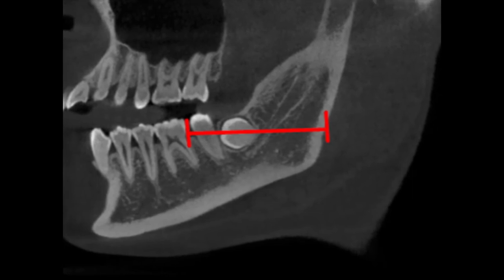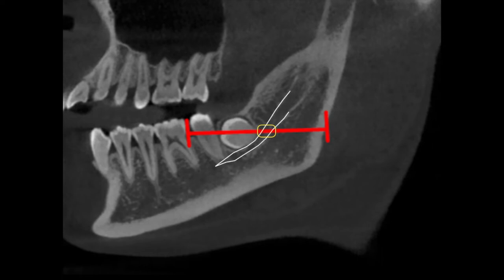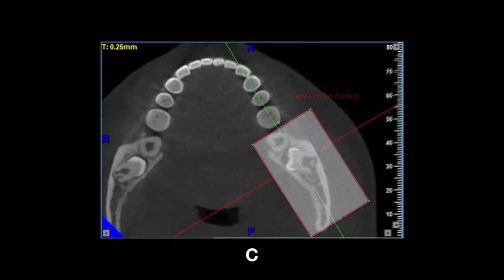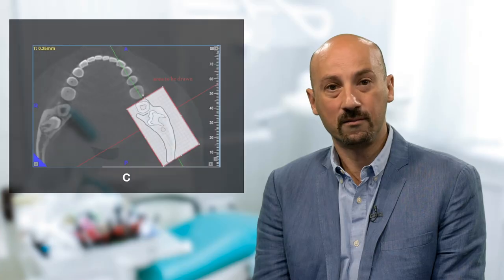We can confirm that if we look into the panoramic slice. Here you can see the actual projection of the nerve on the level we want to reproduce is quite small, because it is ascending at a steep angle. So you might have guessed it by now — the correct image is actually C. This was the third most popular choice. More than half of the participants actually opted for choice D or F, both of which included the longer version of the mandibular canal.